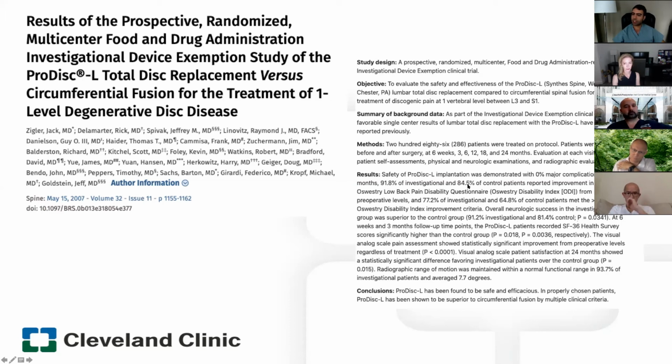91.8% of investigational and 84.5% of control patients reported improvement in the Oswestry low back pain disability questionnaire, and all these other things, okay? The improvement criterion in this study was a greater than 15% improvement in your ODI from pre-op.